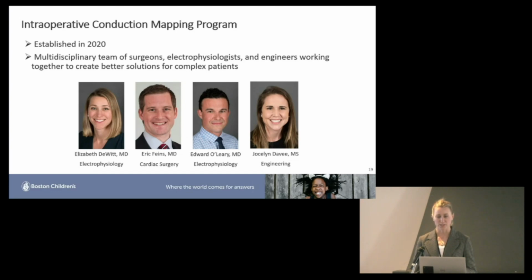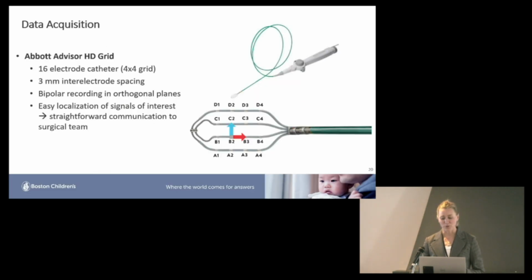And so we started trying to come up with solutions for this about 5 years ago. It's a group of us from both EP and surgery and from the engineering group supported by Dr. Hoganson and others of his colleagues. And we've worked to establish a pretty rigorous and consistent approach to patients both with heterotaxy and without who are coming for biventricular repair, where we look for the electrical signals in the lab.